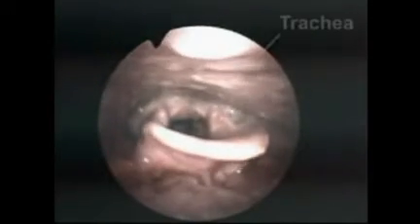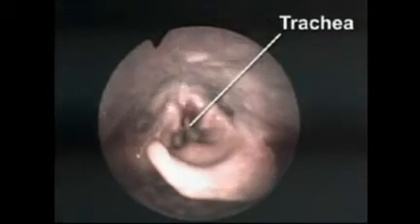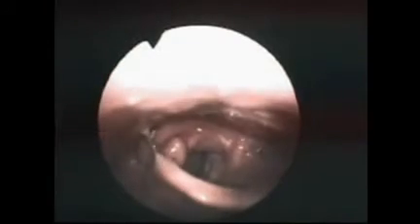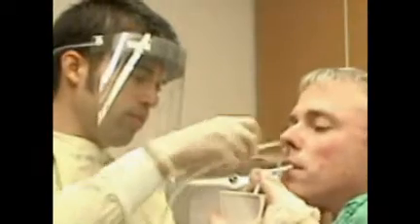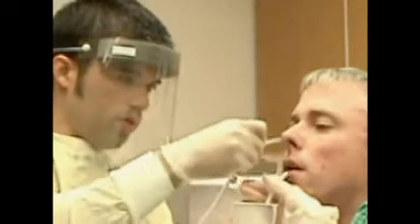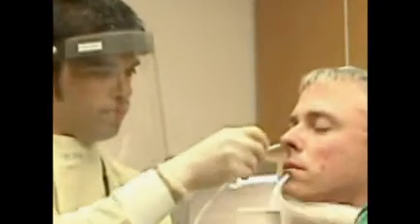As the tube reaches the level of the larynx, advancement is temporarily halted. The tube is then inserted as the patient swallows, and once past the larynx, is rapidly advanced. Note that in this endoscopic view of the larynx, the trachea is frequently open and may be accidentally intubated with an NG tube. Note also that as the patient swallows, the laryngeal apparatus arises and the epiglottis covers the glottis, preventing tracheal entry. Once past the larynx, the tube may be inserted rapidly to the predetermined depth. Check the black markings on the tube to confirm proper depth of insertion.